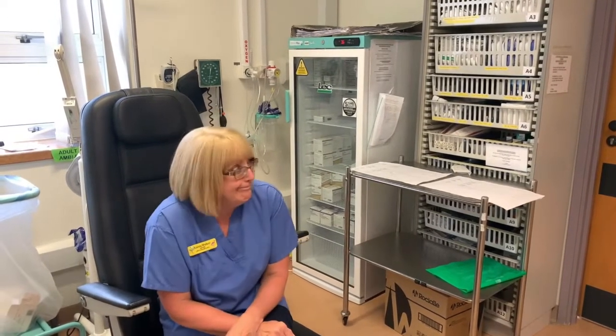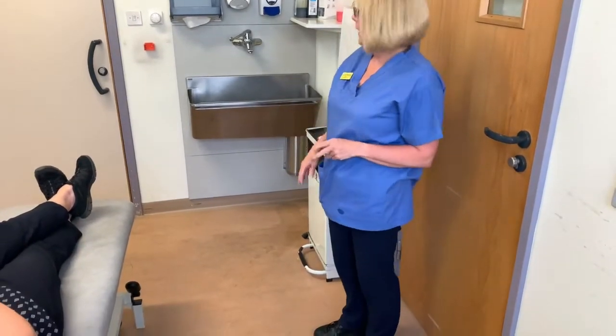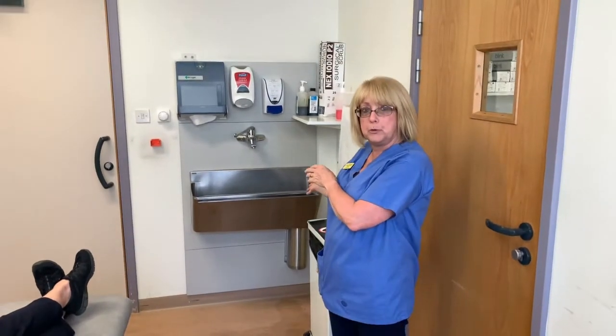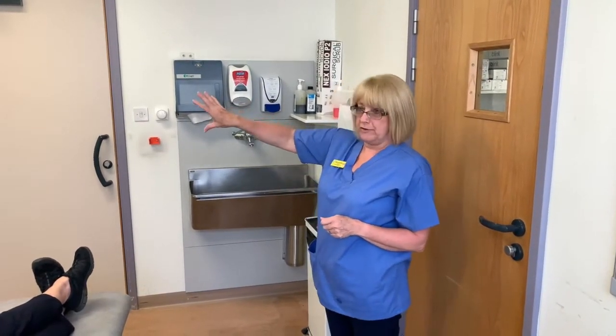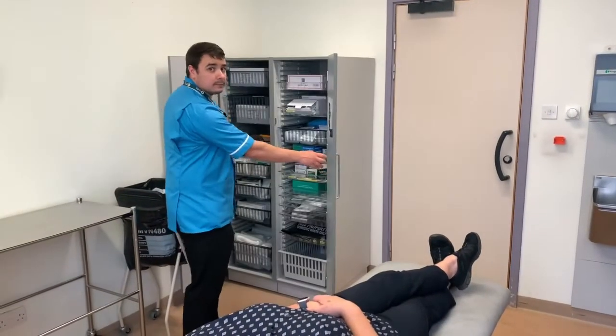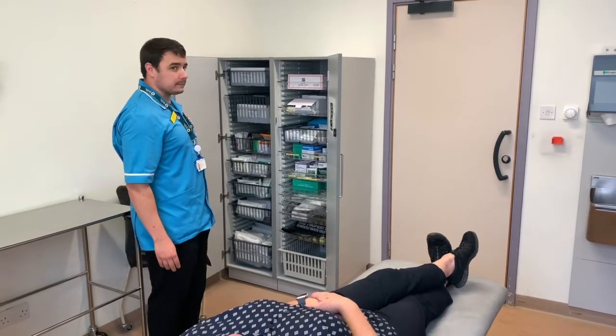It's all right. This is our injection room that has been kitted out as a clean room. We've had a proper scrub sink put in to ensure that we're scrubbing correctly, and everything that we need for the injection is in here, so that we're not wandering in and out at any particular point to get what we need, so it remains clean the whole time that the patient's in here.